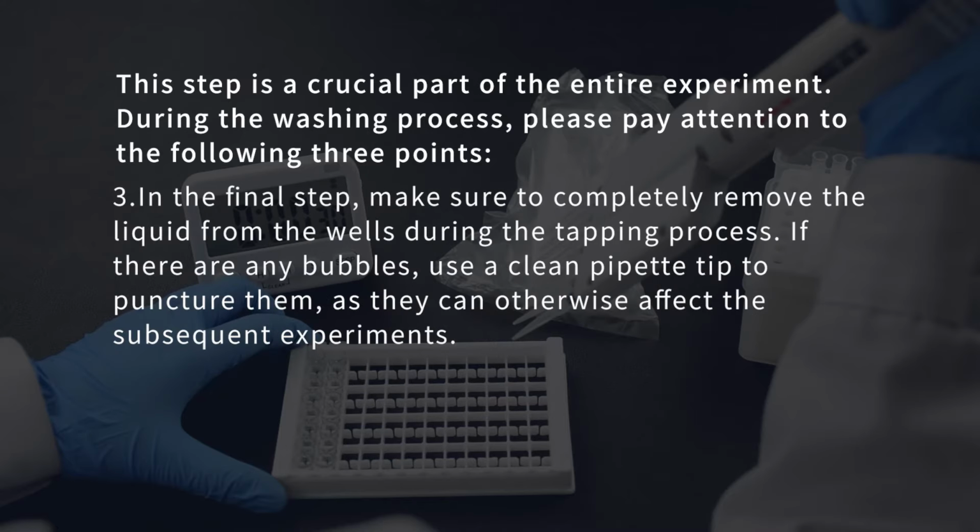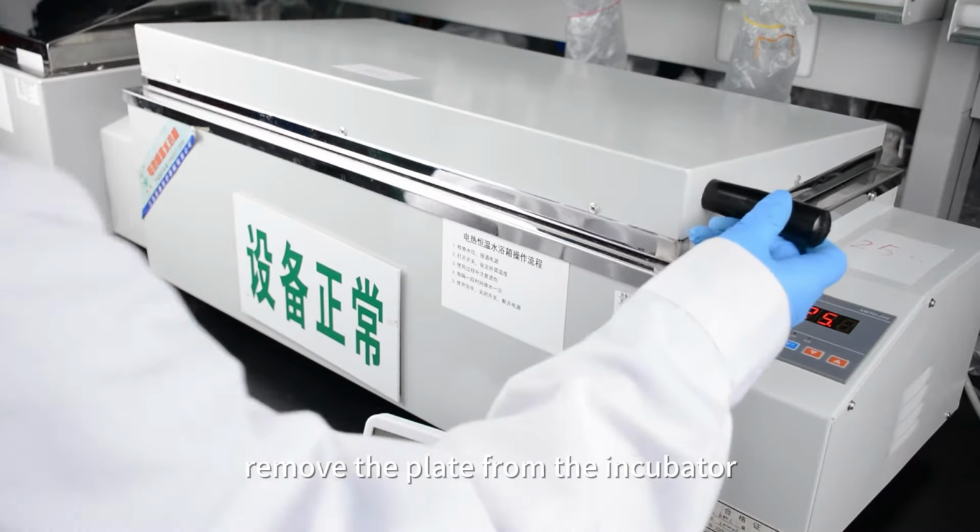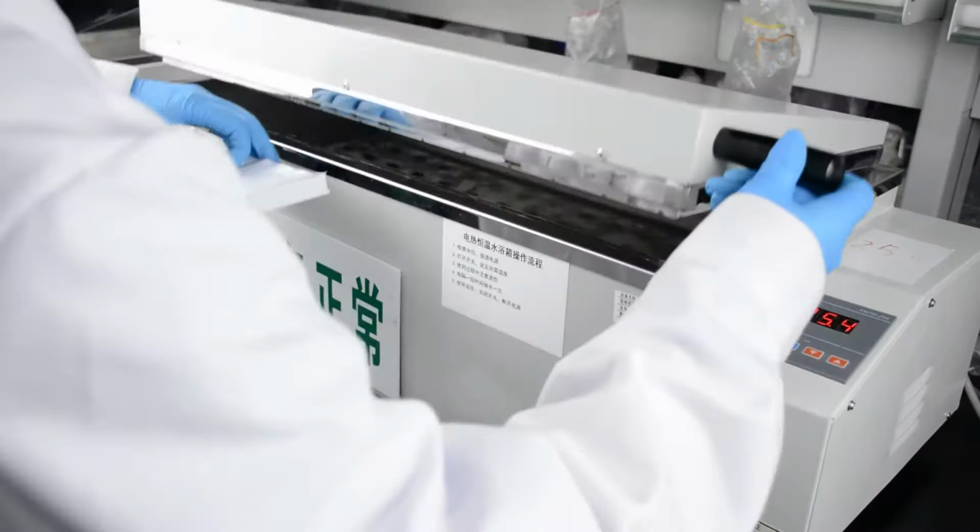3. In the final step, make sure to completely remove the liquid from the wells during the tapping process. If there are any bubbles, use a clean pipette tip to puncture them, as they can otherwise affect the subsequent experiments. After a 30-minute incubation period, remove the plate from the incubator.